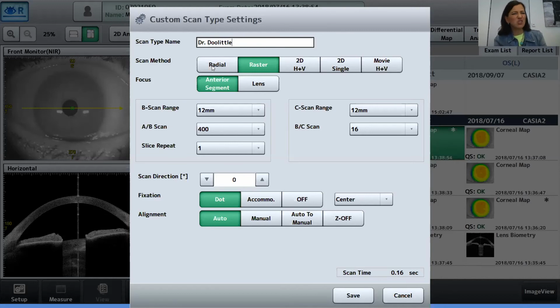Now you're asking 2D, why 2D? I can do a 3D scan as well, that is true, but with a 2D scan you can increase the resolution, you can repeat a lot of measurements and get more information about it, and it's always about the time. The quicker the better it is, because you have less artifacts.